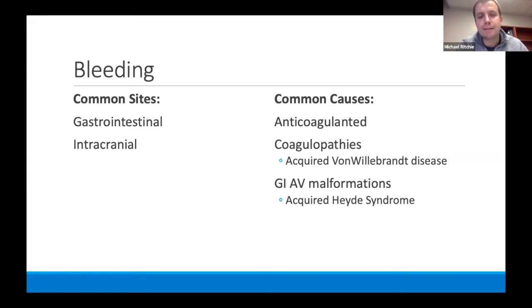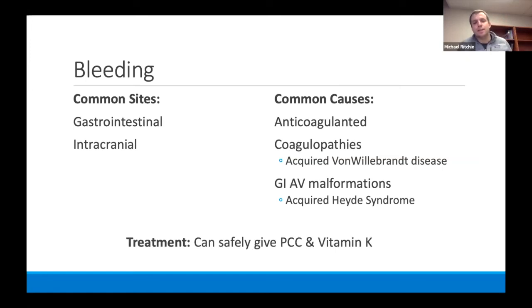And then obviously the devastating one is the intracranial bleed that you worry about. They'll present altered, you get imaging, and they're having an intracranial bleed. And then the question always is, well, what do we do? If you reverse the anticoagulation, they're at increased risk for pump thrombosis. If you don't reverse the anticoagulation, they're at increased risk for increased bleeding into the brain and worse outcomes. So they've done a bunch of studies on this, and they actually have VAD neuro protocols for when you do get an intracranial bleed, and it actually can be safely given.